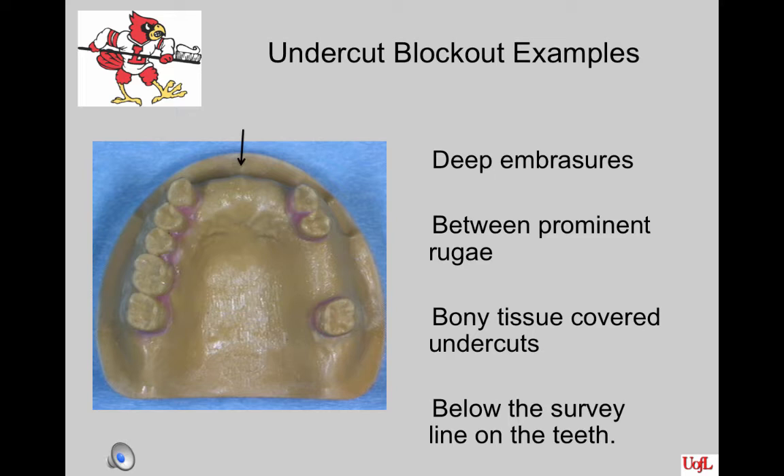The arrows are pointing to some of the areas needing block out to eliminate undercuts. The labial flange may cross a slight undercut and require minimal block out. The deep embrasures require slight block out. There are some prominent rugae that have broken off when the triad got caught under them, and the infra bulges on the lingual and proximal surfaces of the teeth are required block out.